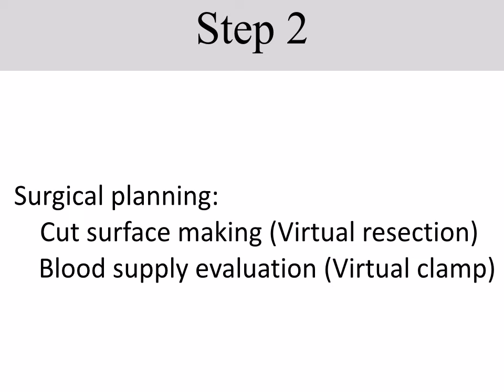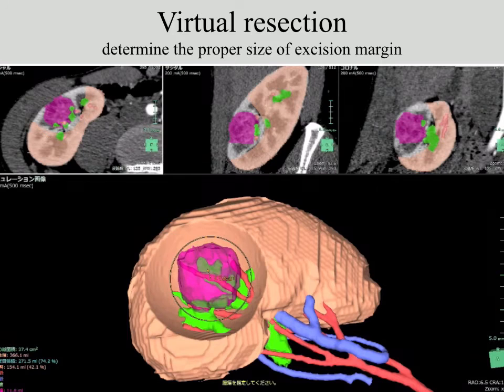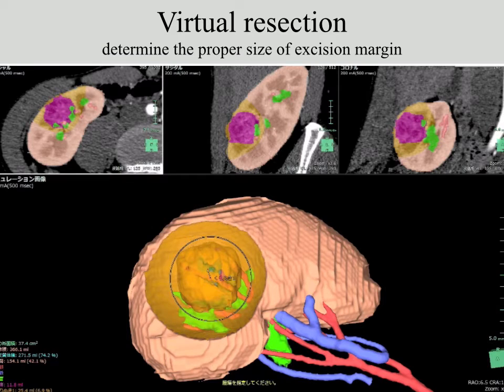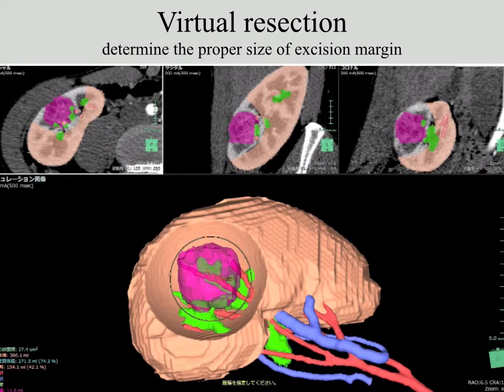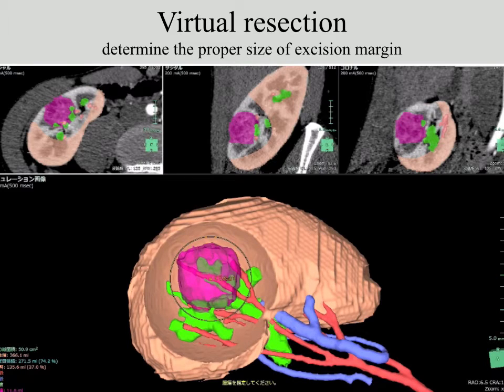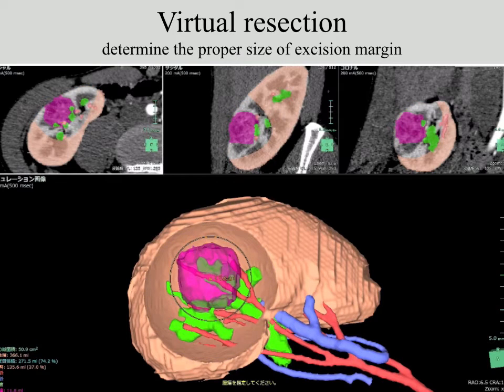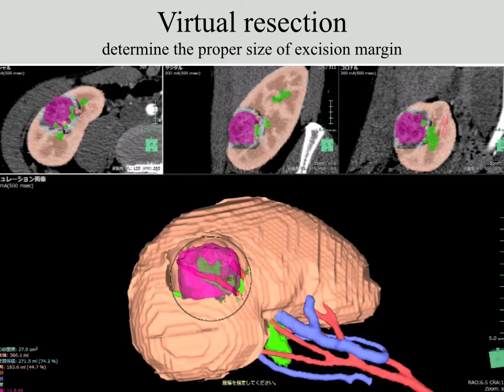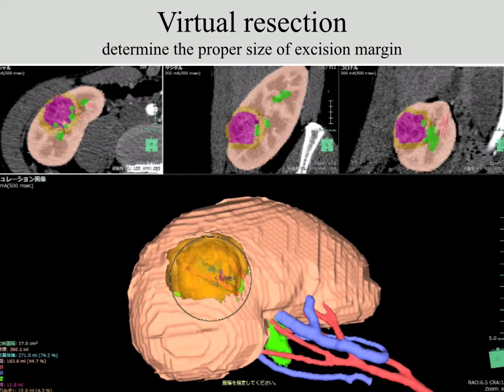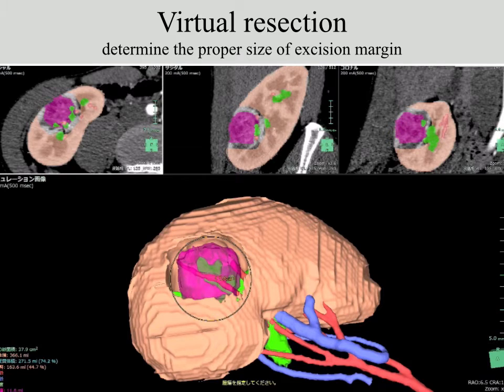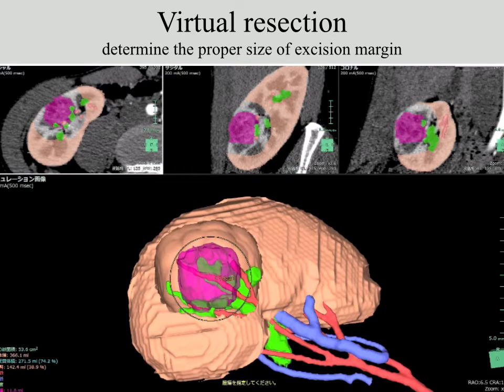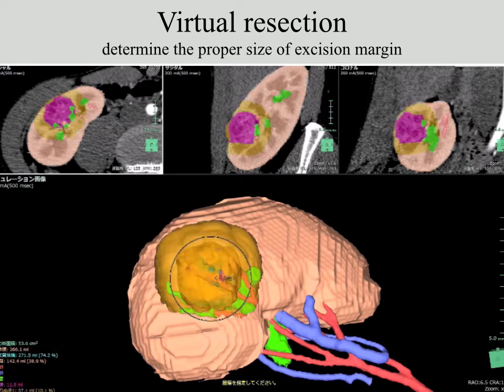The second step is the very important step: surgical planning. It consists of two parts — cut surface making and blood supply evaluation. First, we determine the size of the excision margin of the tumor using imaging software. In this step, we are able to cut the virtual kidney with any margin setting and cutting angle. We can observe the cut surface through the opaque resection margin. If the collecting system appears on the cut surface, we consider it as opening the collecting system. We are also able to see the arterial involvement at the cut surface. These are very important pieces of information to plan the margin size, avoiding both surgical complications and positive margins.